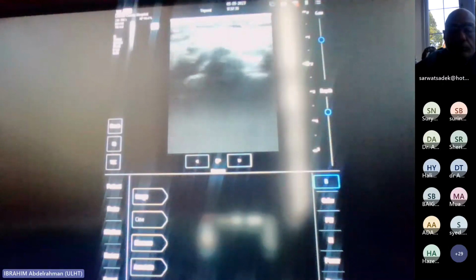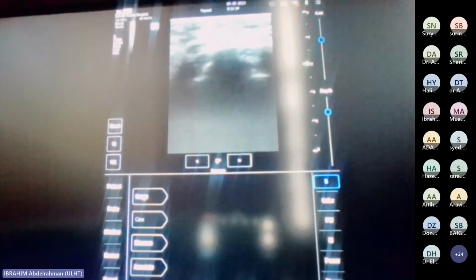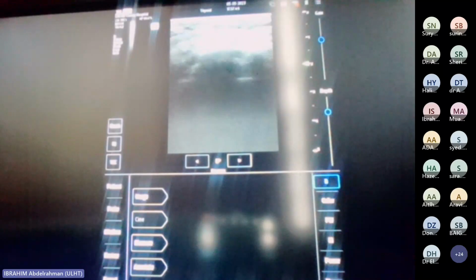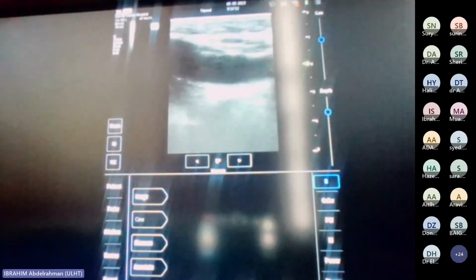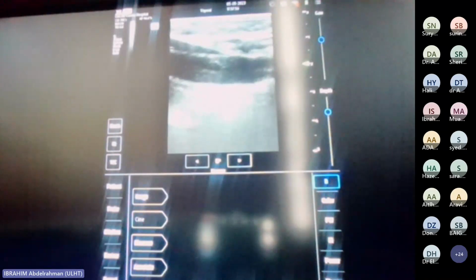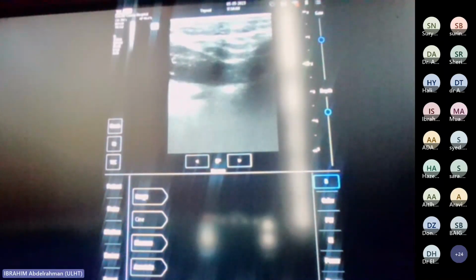Okay. So this is the superficial skin. This is the patient's back. This is the left, this is the right. So skin's fine, left, right, if you're holding the probe like that. The only other way really you should hold the probe is like that. And then you've got patients. So just move up for me so you can check. So patient's head, patient's feet, and then skin and spine.